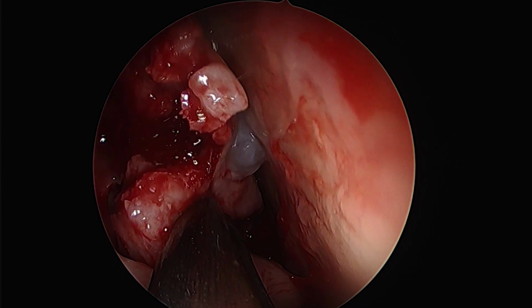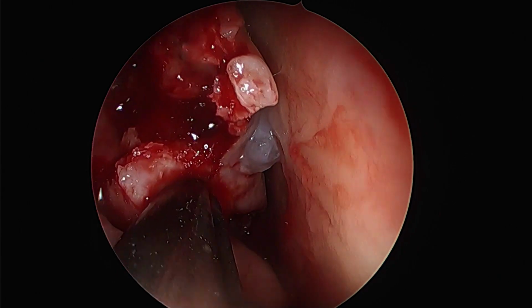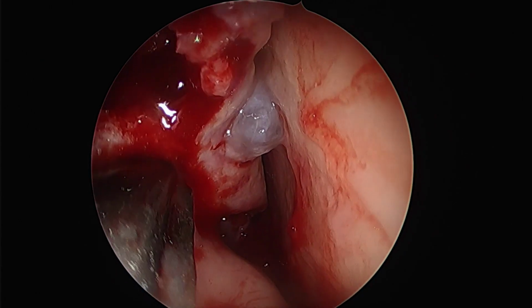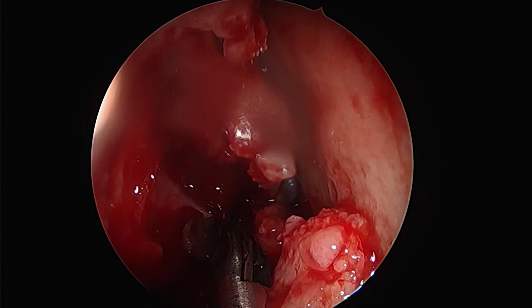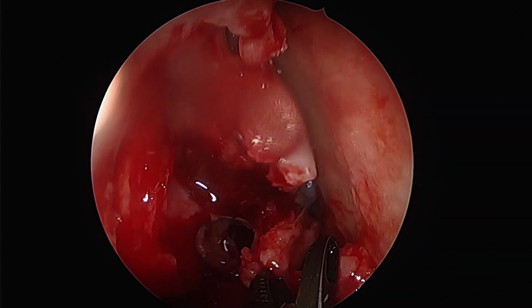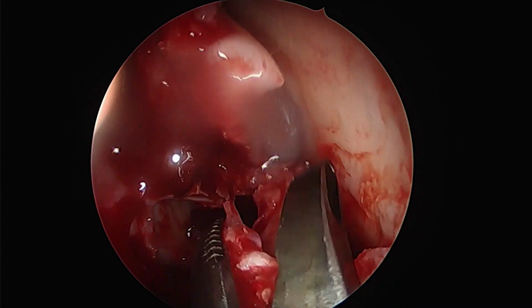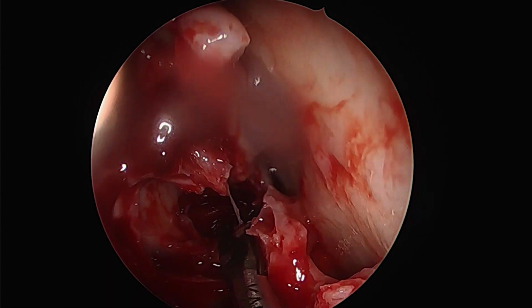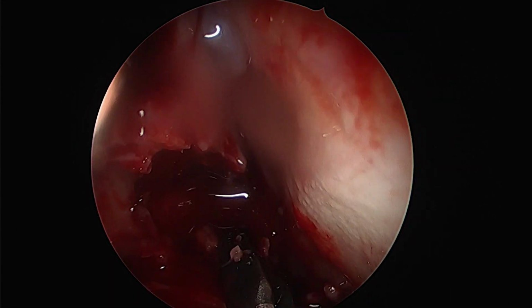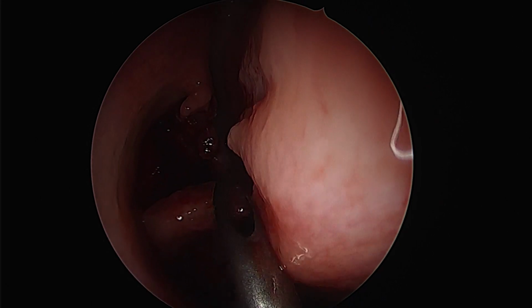One can now begin seeing the meningocele, which is medial to the middle turbinate. Here we see it with its pulsations. This is the site of the CSF leak. This middle-aged lady, 55 years of age, has already had 2 episodes of meningitis in the past 6 months, and this leak was identified on the endoscopy as well as the CT PNS and an MR cisternography. The leak is very well visible. The meningocele is very well visible towards the posterior part of the cribriform plate.